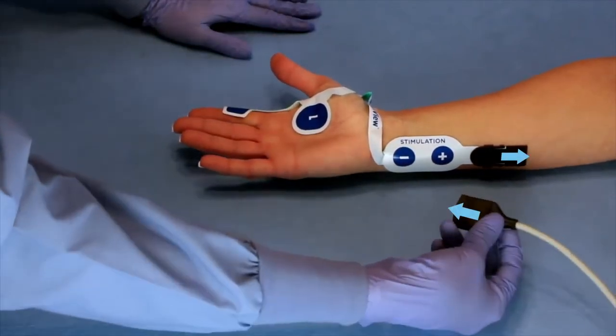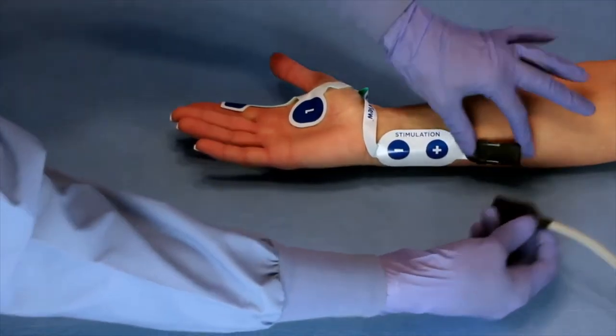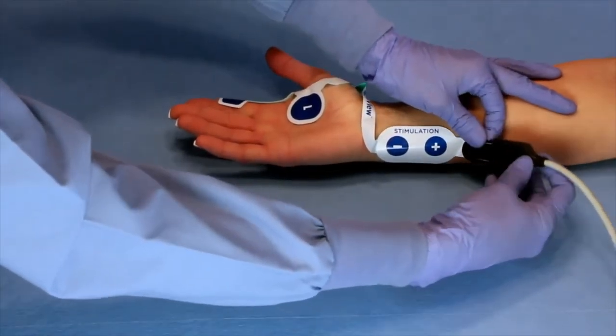Connect the electrode to the cable, making sure that the arrows are pointing up and towards each other.